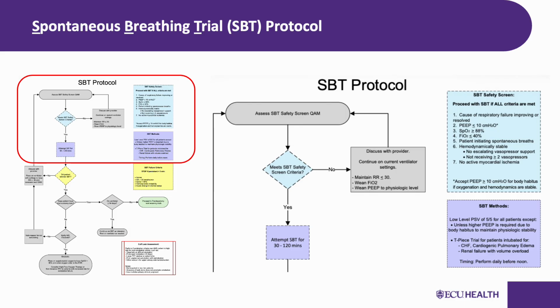In plain language, these parameters are decent at telling you a patient might fail, but they're not reliable at confirming a patient will succeed. And more importantly, 2 separate systematic reviews concluded that weaning parameters do not meaningfully change extubation outcomes. Whether you measure them or not, the patient's actual performance during the SBT is what matters.